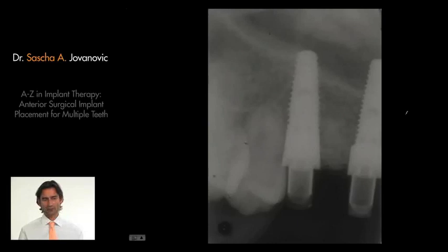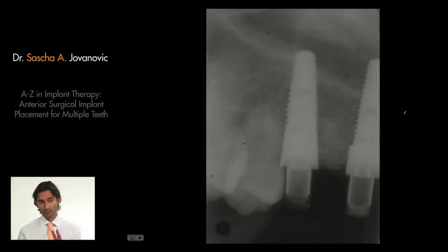So this is an option which is possible to thicken bone, to thicken and support soft tissue by creating some material using artificial material. But it's important to conclude from this patient that this patient was first treated with a very biological approach of grafting. Secondly, implants were placed, so it was very conservative. But then thirdly, we're augmenting everything with filler material. So we combined treatments, separated all these steps, and you can see a nice end result.